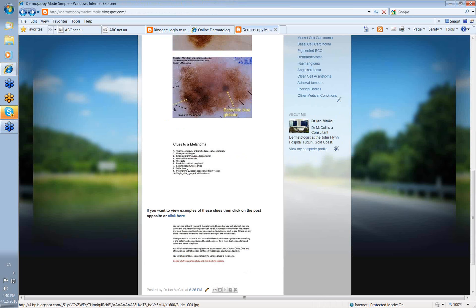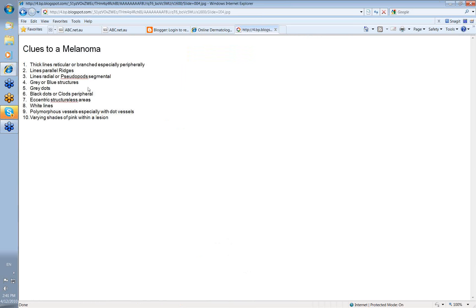So what are the clues to melanoma when you're looking at something? Well, these are the clues that are generally recognized. Some people have more, some have less. First of all, thick lines reticular or branched, especially peripherally. So you've got, as you saw in that last one, thick lines reticular at the periphery, then suggestive that this may be a melanoma.